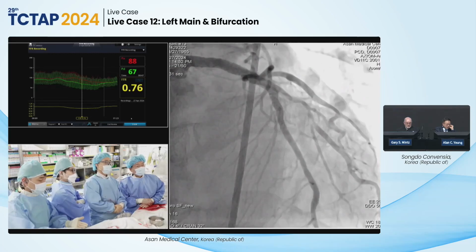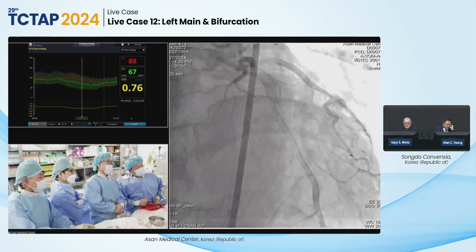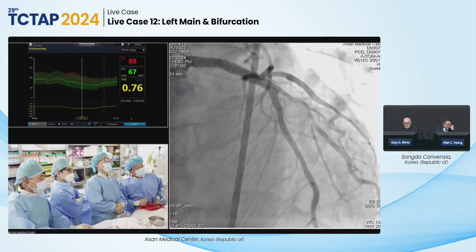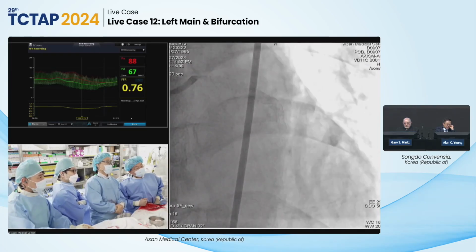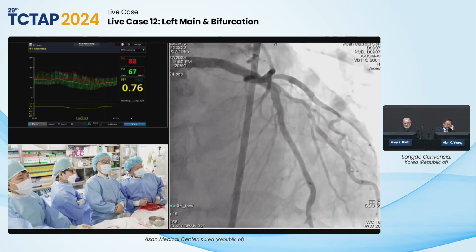You fixed two very big territories, the right coronary that you fixed a few days ago, and this big territory in the LAD. The diagonal is much better, right? It was 0.5 something, and probably lower if you really look at the restriction. So I would probably leave it alone at this point.